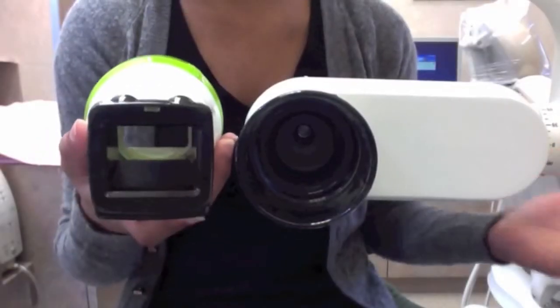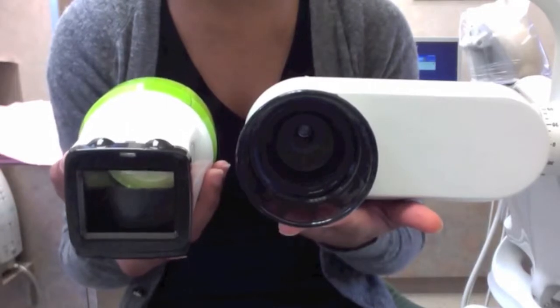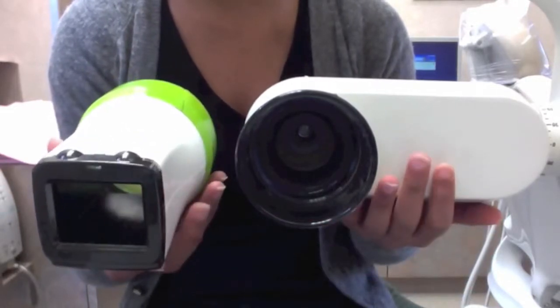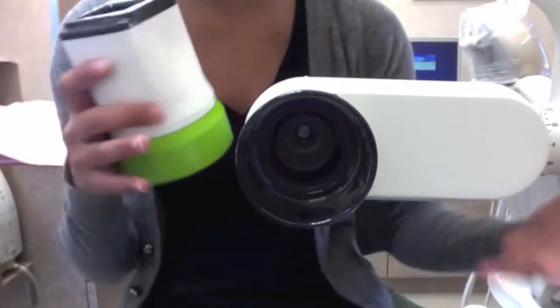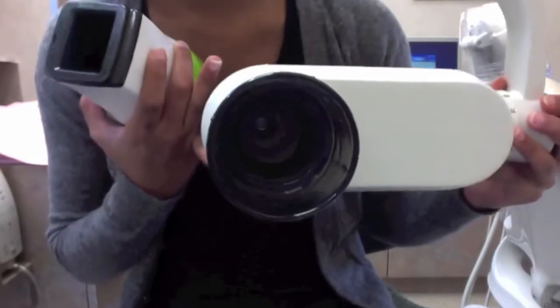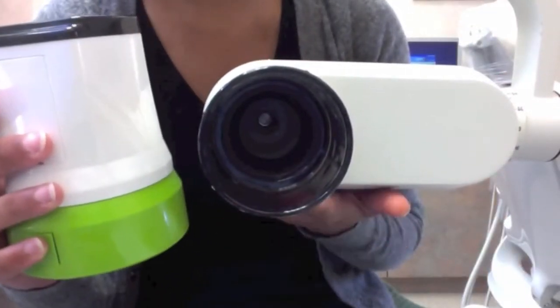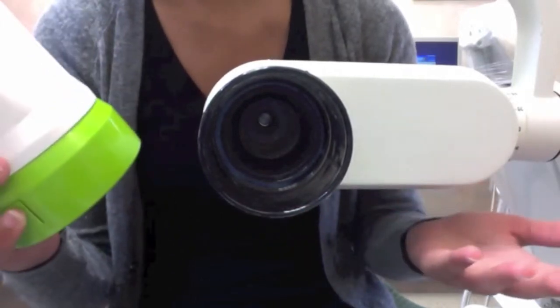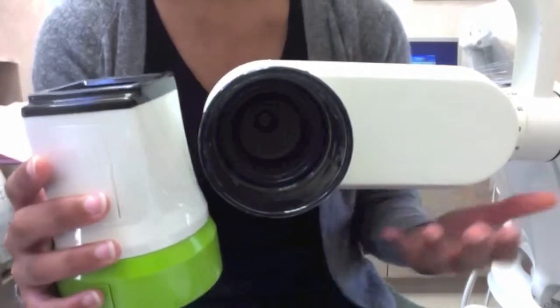So collimators not only vary in their shapes, but they also come in different sizes. They can come in two different lengths. They can come in either an 8-inch, which is the shorter one. This is the 8-inch. This is also the short one. Or they can come in a longer collimator length, which is 16 inches. We all know that long PIDs are usually preferred because they reduce the divergence of the X-ray beam.